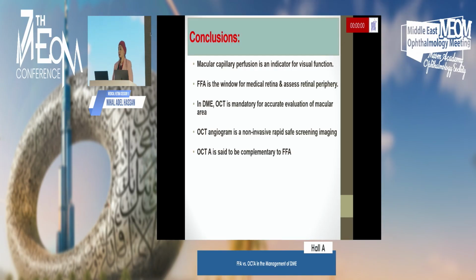But again, I can conclude that the macular perfusion is very important, and this can be fully assessed by OCTA. But fluorescein angiography still remains, and I think it will never die, because gold is gold, as we all know, that it's very essential in other types of retinal vasculitis and retinopathies. So one day we will not get rid of dye injection.